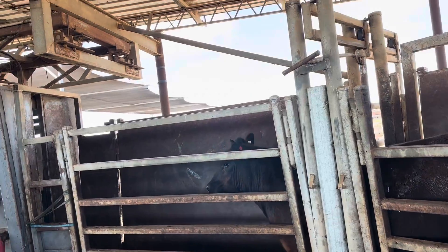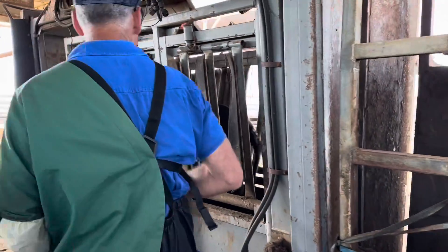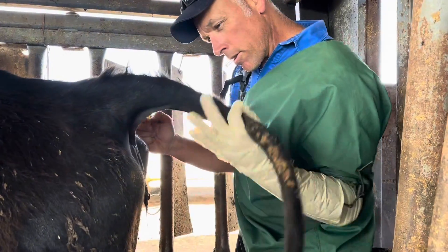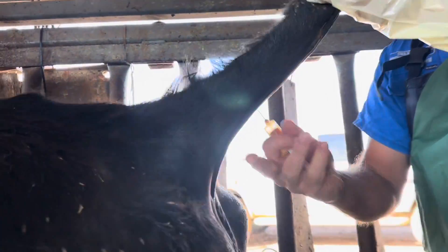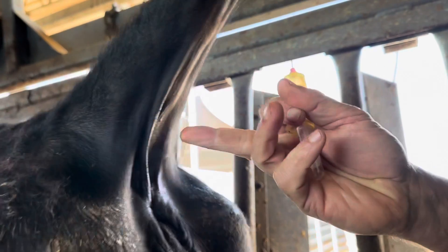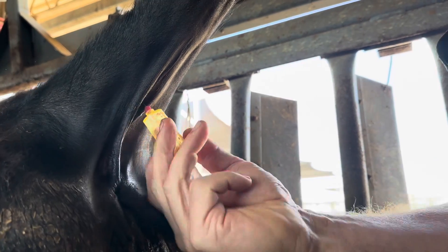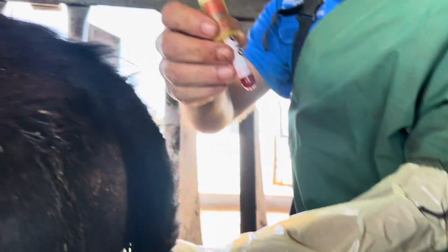Come and video me taking blood — I'll explain it to you. Stepping into my office. Jack the tail. Have a look underneath — see that? See the bones there of the tail? You can see a little dimple in between — that's right in the middle of the bones. You just hold the blood tube like so — puts the vacutainer up. Voilà. That's how we bleed them — that's as easy as that.